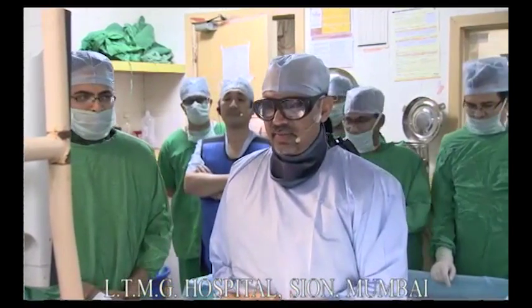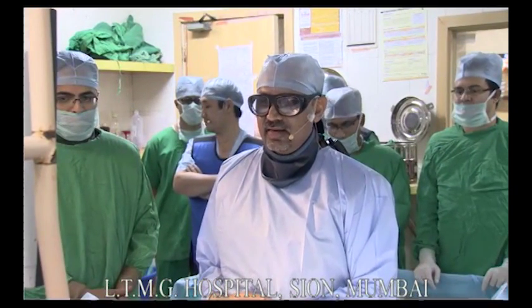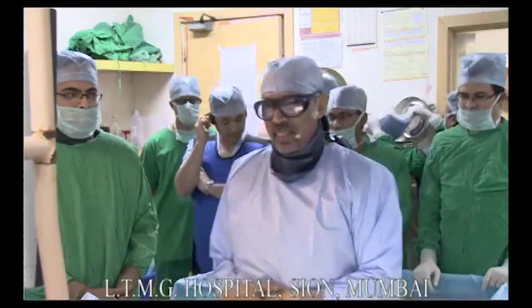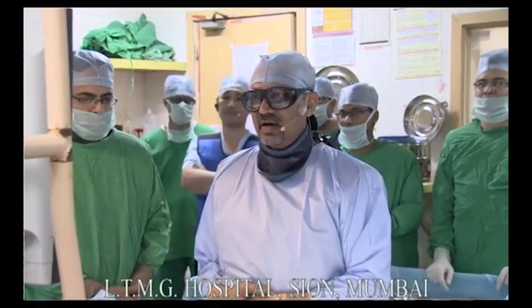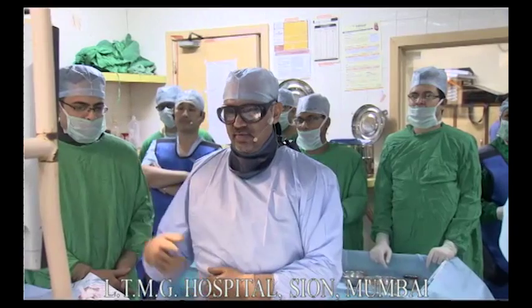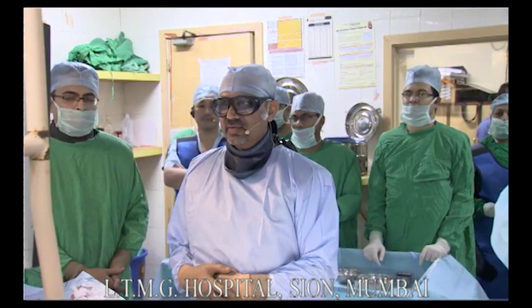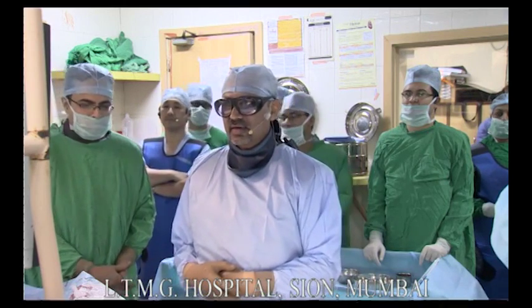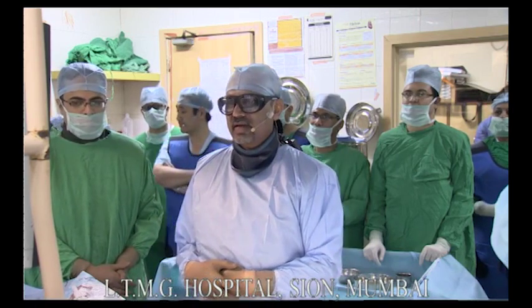He is 53 years old, diabetic, with chronic stable angina, and his angiography is suggestive of double vessel disease. The LAD has a long segment tapered lesion of around 70 to 80% severity. We can show that picture. And in the RCA, there are two critical tandem lesions. So we are planning to put Meril's research product, the Morph tapering stent, in this particular case.